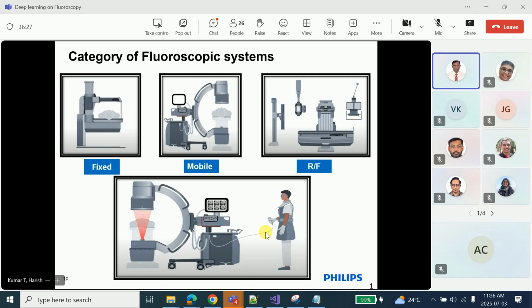You see all those high-end C-arms and high-end cath lab machines where cardiac angios are done, because they're very high-end. You need to capture images within a fraction of a second, because if you lose it, you cannot repeat. Contrast can also have very adverse effects on your body. You can have a mild reaction, or an intermediate one. Have you heard of contrast reactions? Anybody? Anyone online?